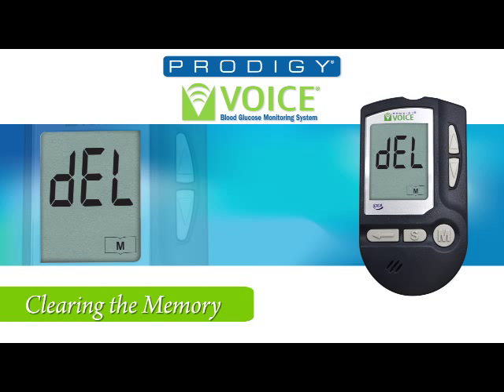The final step in this setup, you will hear: 'Volume level 2. The date, March 17, 2011. The time, 11:30 PM. Milligrams per deciliter. Goodbye.' The Prodigy Voice is now set.